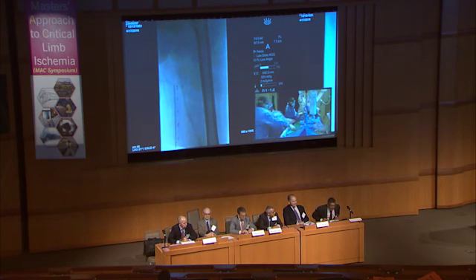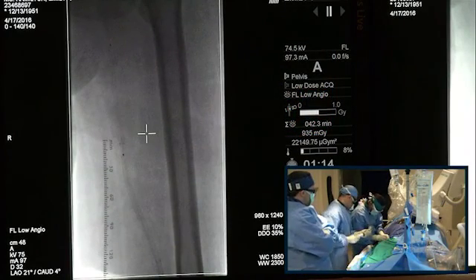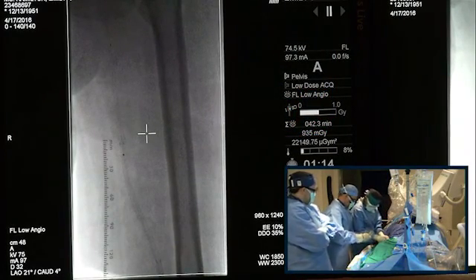It is looking good. So another stent here, Mary, quickly. No, so we go now. We're going with the DCB now. So we have a 6 by 120 Impact DCB, and we're going to go there. Right there is good, yeah. So we're going to go up with this.